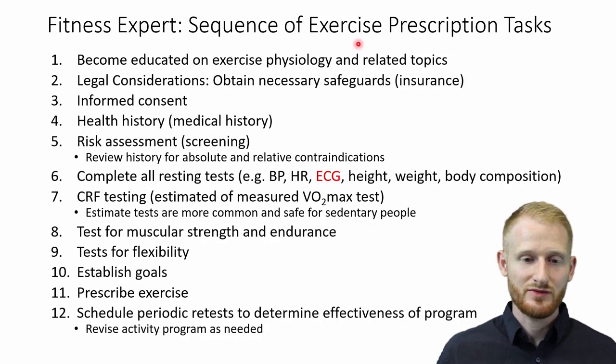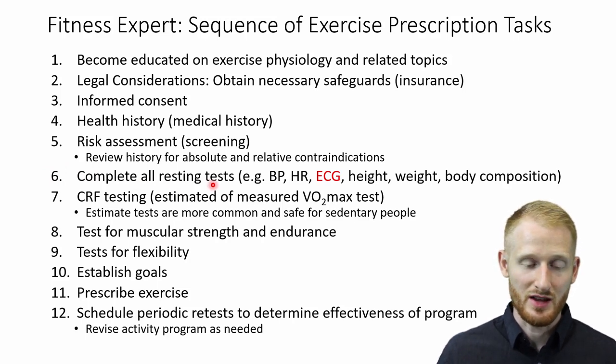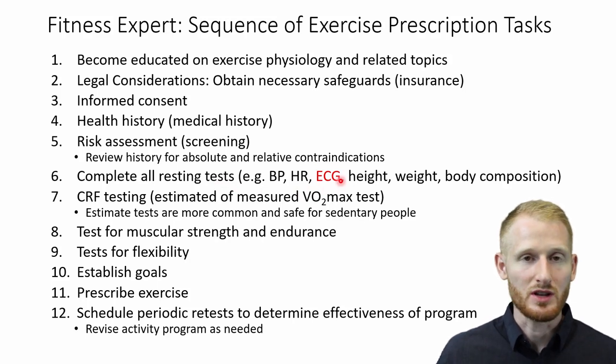Looking at the sequence for exercise prescription tasks, we are on step number 6, which is the resting test that you do before doing anything exercise related. And we're specifically talking about ECG, or electrocardiogram.